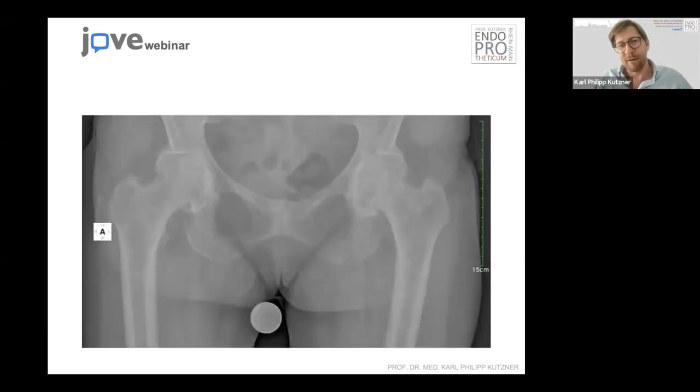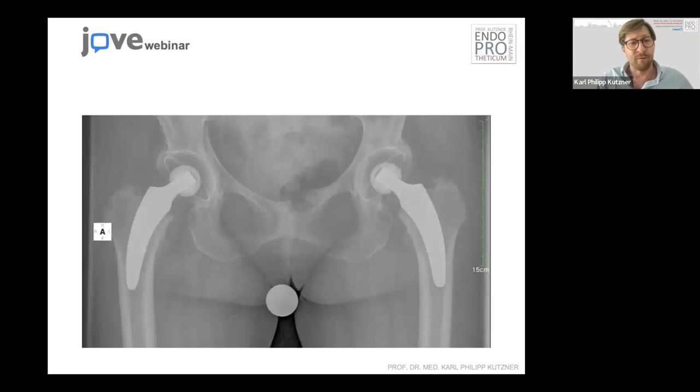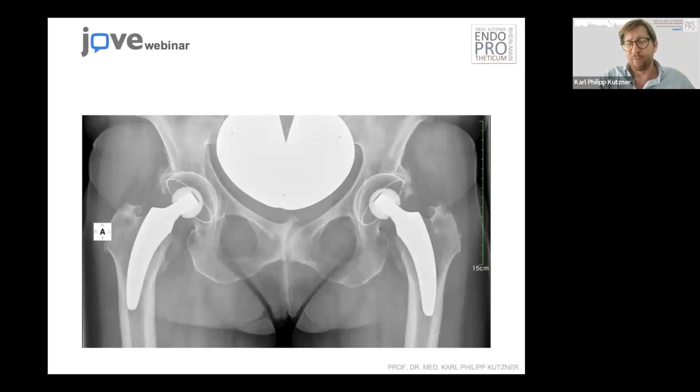This is another example with similar anatomy. This is the short stem philosophy — metaphysial anchorage — and at 10 years from the operation, it looks like this. It's quite remarkable: the calcar is completely preserved and there's a lot of bone left in case of revision. We could probably do another short stem or whatever. This makes quite a difference.